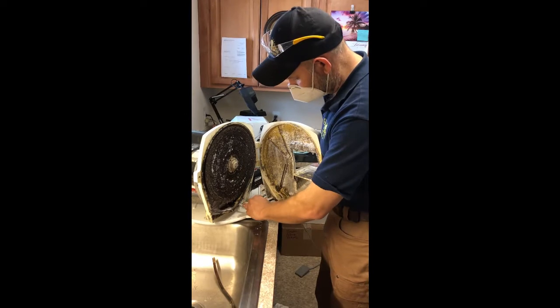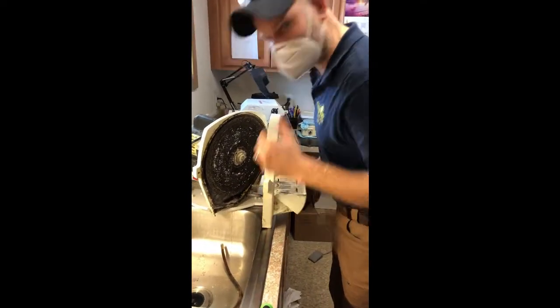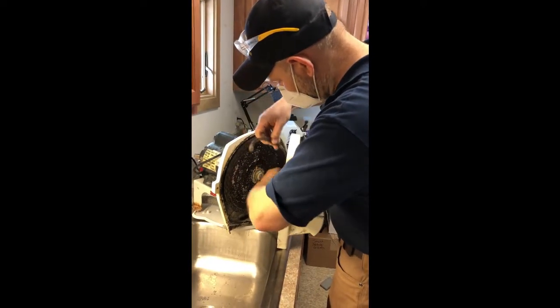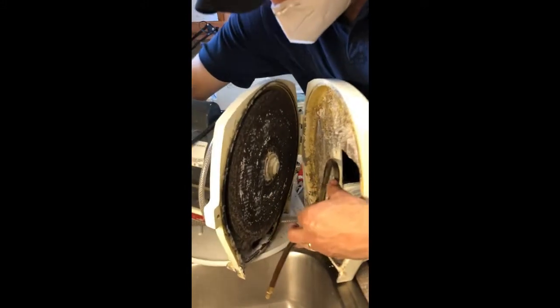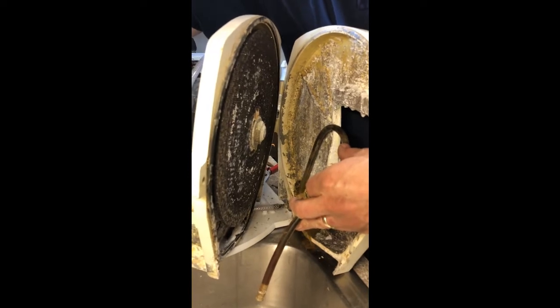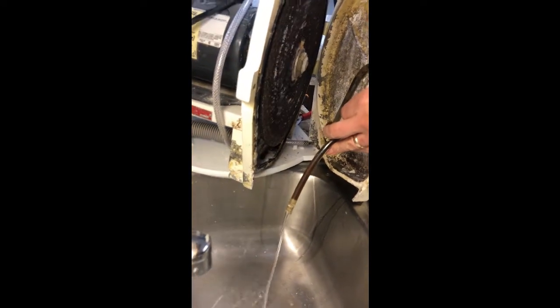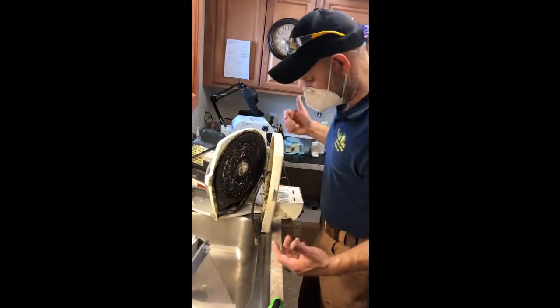So chucking up a piece of wire on a drill is going to give you a very useful tool when dealing with these. We'll put our hose on here just to kind of block the flow. We previously thought it was clogged, so we'll turn this guy on, and we're expecting water to flow pretty good. That's what we were not getting before, and we were able to clear it with the wire.